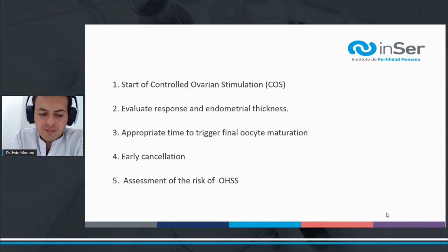prevent its presentation. However, the need for intensive ultrasound monitoring is controversial because it's more time-consuming and expensive, and associated with greater discomfort for the patient. But given the benefits of ultrasound monitoring are well established and practiced worldwide, we should do our best to seek the best results by performing an ultrasound with the most appropriate methodology.